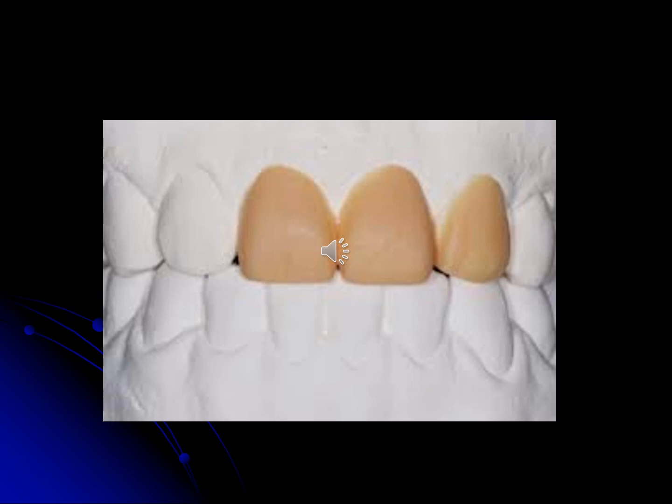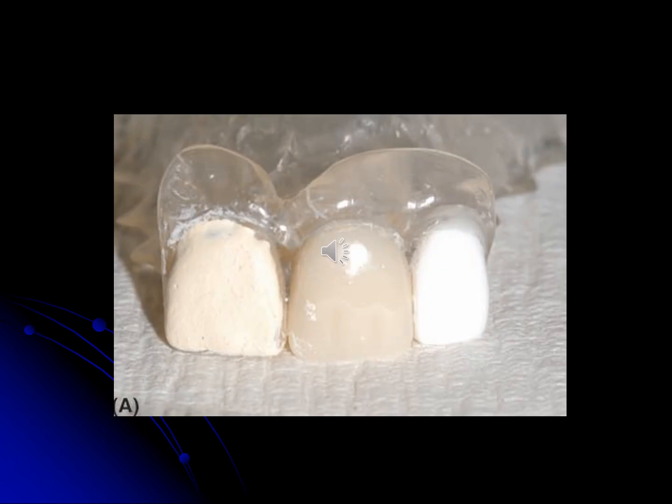Now we design the prosthesis and we see the future of the case. The second step after preparing the wax-up: we convert the wax-up into a radiographic stent. This is the radiographic stent. What is the radiographic stent? As I told you, it's a clear acrylic denture provided with radio opaque material, to be shown in the X-ray when we take the X-ray for the patient.